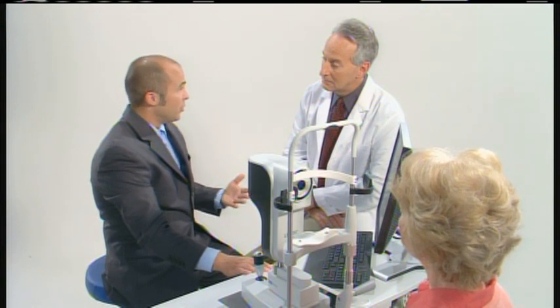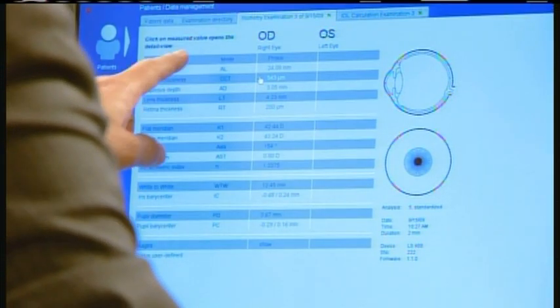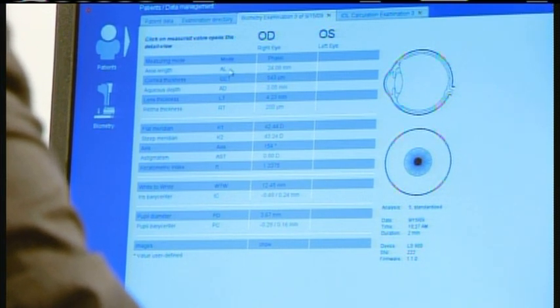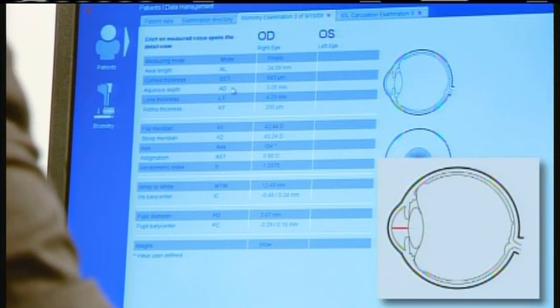We can capture pupillometry and white-to-white measurements as well with the device. So let's go in and look at the software. When we open up the software, you can see all the different measurements that we were able to catch when the trigger was pressed. So we get the axial length, the central corneal thickness, anterior chamber depth — which is true anterior chamber depth, from the endothelial layer of the cornea to the anterior surface of the lens.